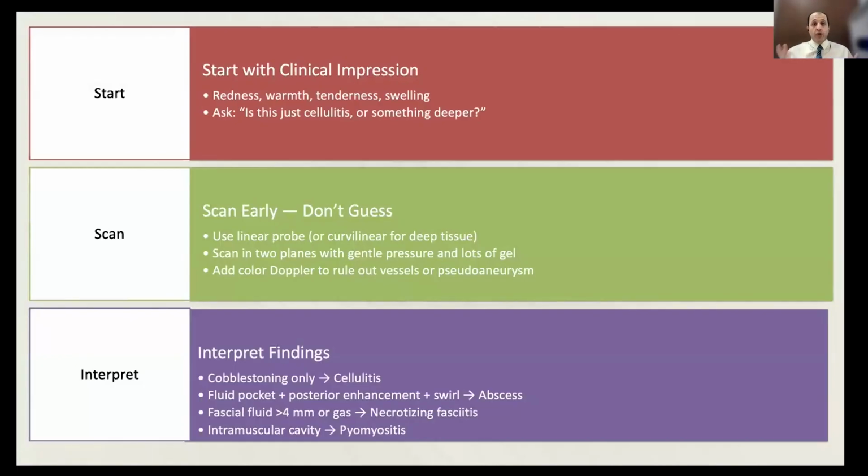So what I usually do for my cases in the emergency room when a patient comes with soft tissue infection: the patient usually presents with redness, warmth, tenderness, swelling, and fever. The first question I always think is, is it just cellulitis or something else? And then I will go with my POCUS. I choose my probe based on the case and the body habitus of the patient. Am I scanning some anatomical location like thigh, buttock, or do I just want to scan fingers and toes.